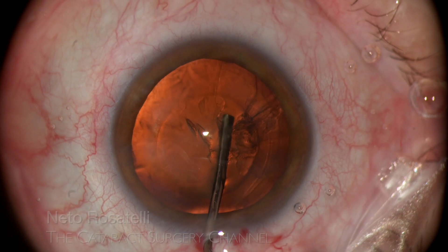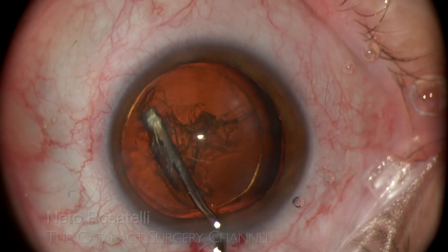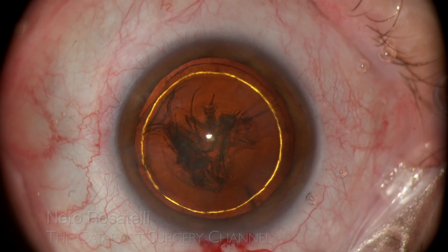Hydrodissection and hydrodelineation follows, facilitating cortex release from the capsule. Who doesn't like to see a beautiful golden ring?